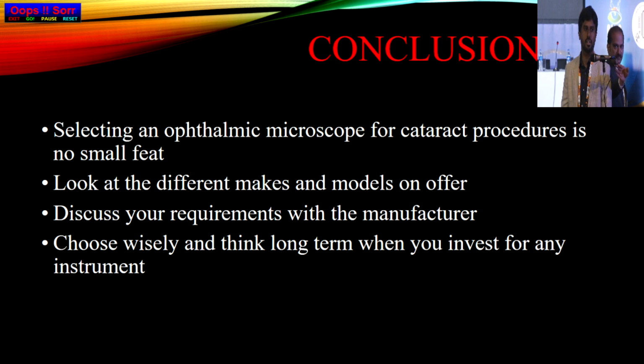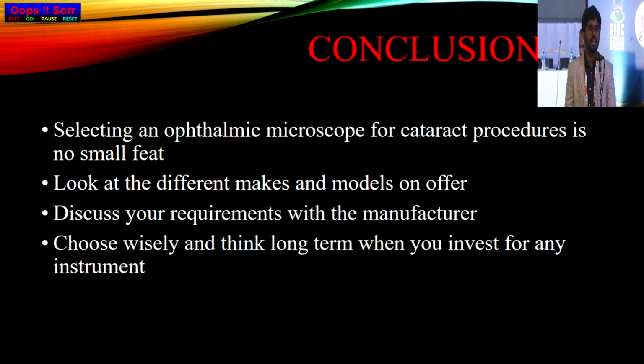One shock that I got: for servicing my Zeiss microscope, I called a Zeiss person to come and do it. That was the first and last time I called them, just to service it, to clean the optics, and to ensure it runs. I was charged 45,000, way higher than my surgeon's fees for about 4 to 5 cases. So never do that. There are a lot of people available freelancing who will be able to do a very good job for 5 to 6,000, maximum 5,000. They will be very happy if you pay them 5,000 for that half-hour, 45-minute job. The only thing with a microscope is that fungus is one problem.